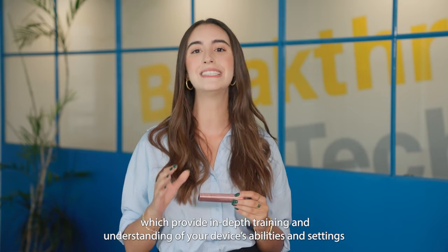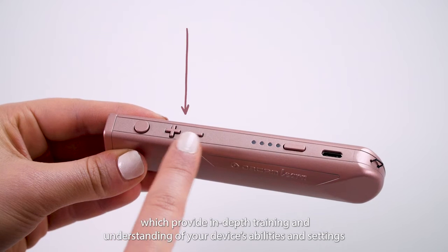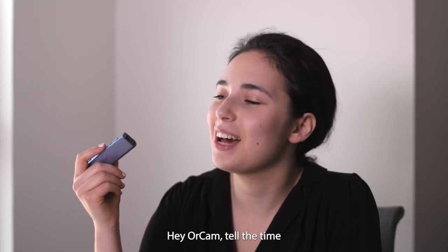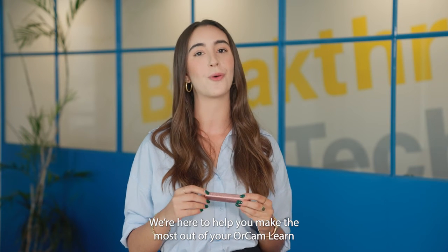A series of tutorials follows this video, which provide in-depth training and understanding of your device's abilities and settings, including using the buttons and voice commands. Enjoy using your new device and feel free to contact us with any questions or issues. We're here to help you make the most out of your OrCam Learn.